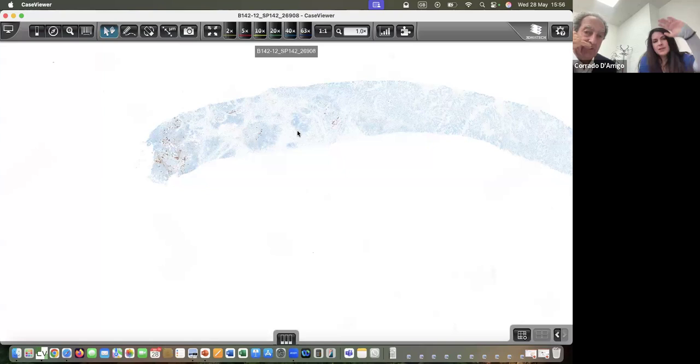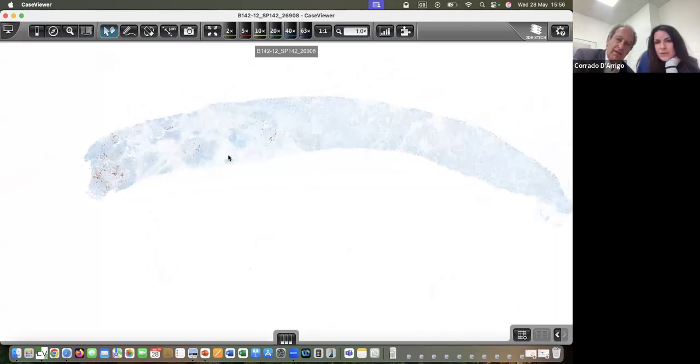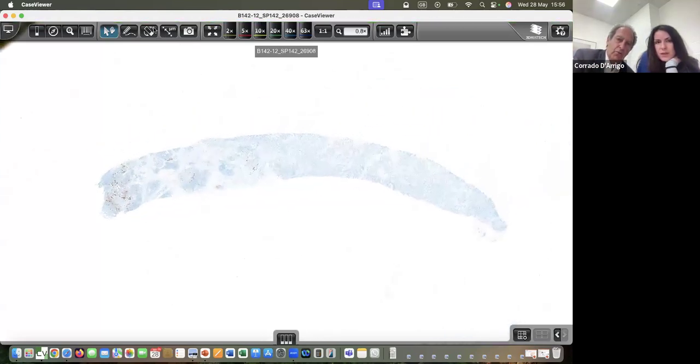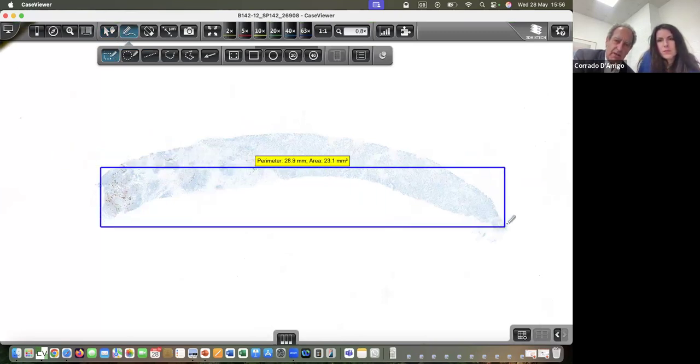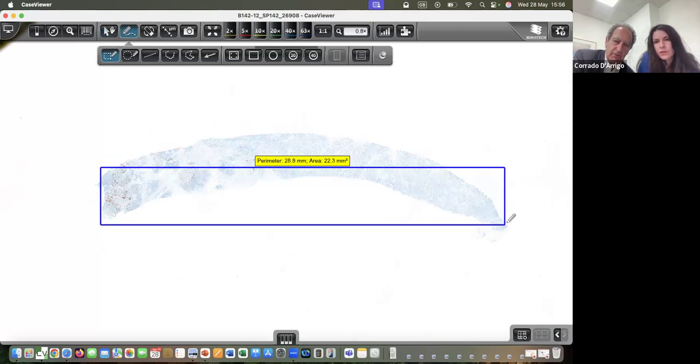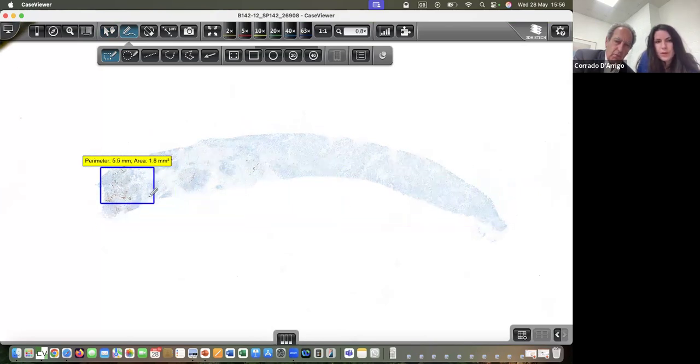And it's possible that this is some sort of edge periphery of the tumor, and there's a large mass. And again, to give us a ballpark understanding of what we need, the area of this is around 22, 23. So we need 0 point something like this. Well, we can easily find that little 1% here.